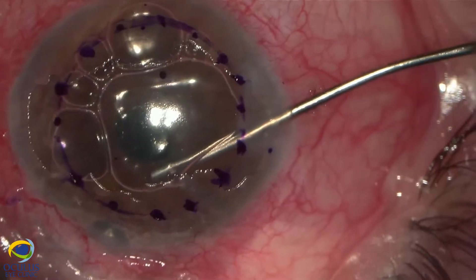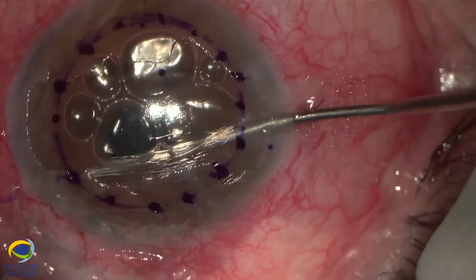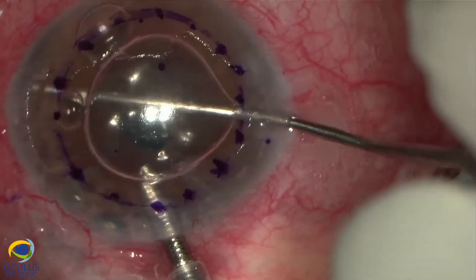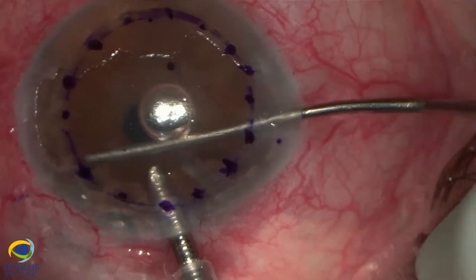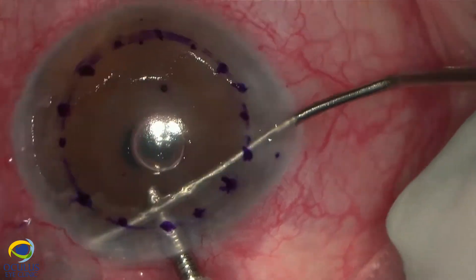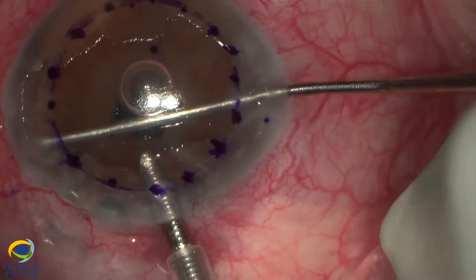We can do this under air with a spatula using gentle detaching maneuvers, but the air has a tendency to escape through the paracentesis, so we placed an anterior chamber maintainer and continued to detach the synechiae on both sides of the eye under BSS.